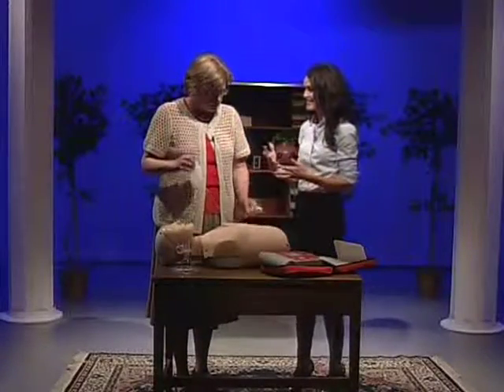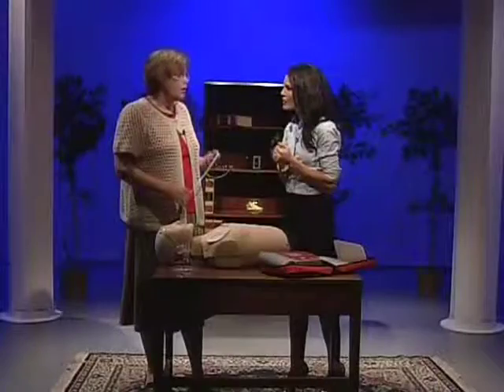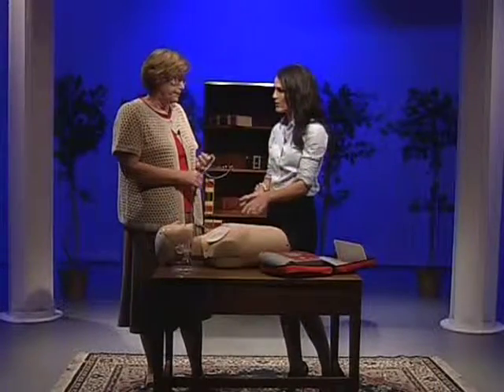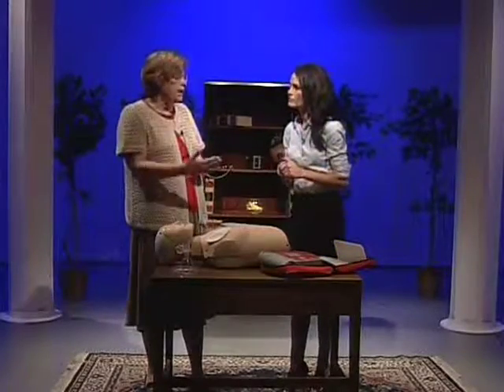And so the training that we would receive on the particular device would tell us that. If I hadn't received training, how would I know that? Or would it just be okay for me to go ahead and use them? You can go ahead and use them, but again, what we would really want you to be doing is talking to that 911 dispatcher, and they are going to know all of that.